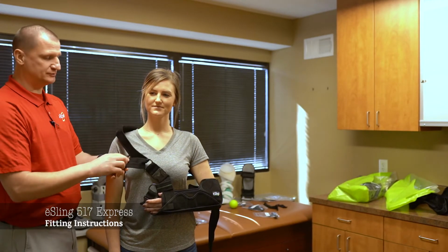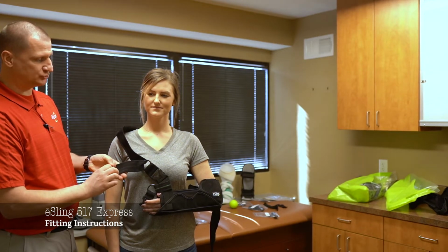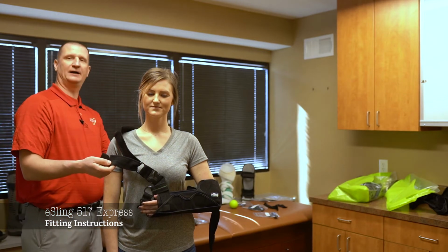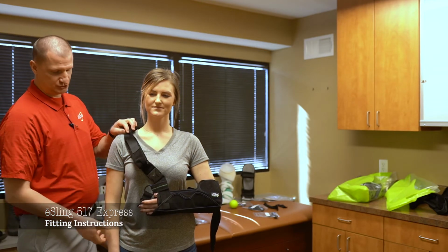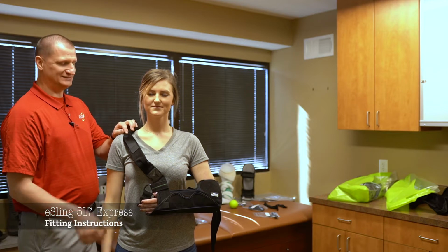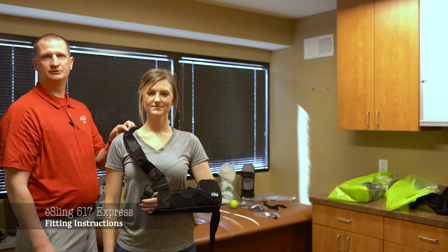Both of these straps have a Y strap on them, okay, or what we call an alligator strap. So this strap can be cut in the front and the back to position this padding. Okay? We're going to try to keep this strap in the front of the patient so she can get to it with her opposite arm, okay? So she does not have to reach over top of her shoulder into her back, which would make adjustments pretty difficult.